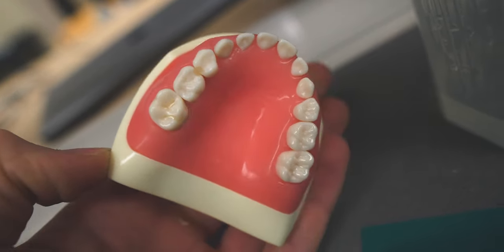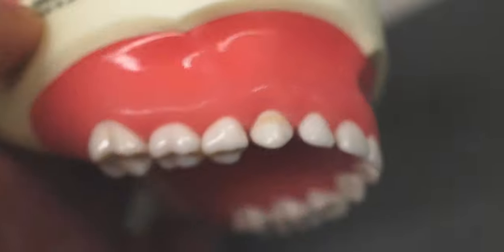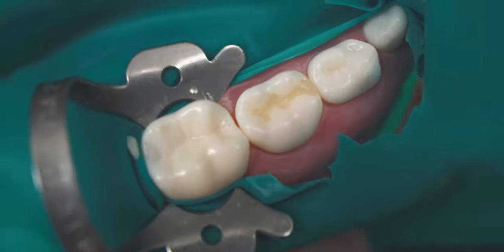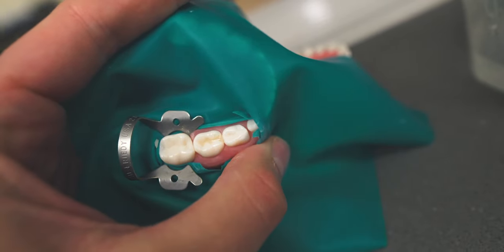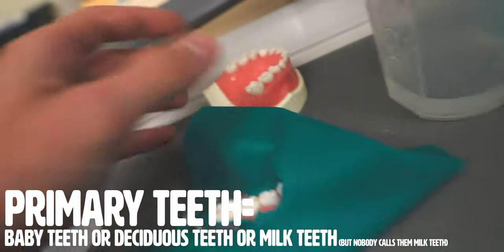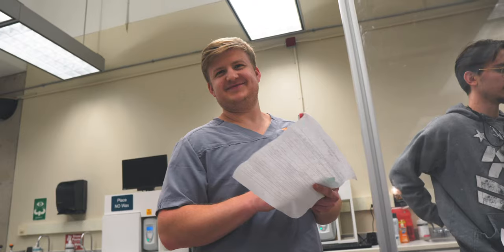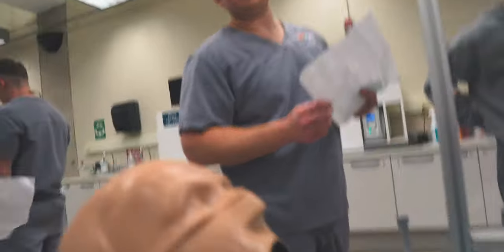You can see some of the composite restorations in these teeth — there's a class five right there, cervical decay. I did those last lab, and they look pretty good. Now I need to do a stainless steel crown on tooth S. The numbering and lettering system is different for primary teeth, so we're working on kids in this lab, which is new for us. I'm going to prep the tooth first and then see if I can get another crown done.